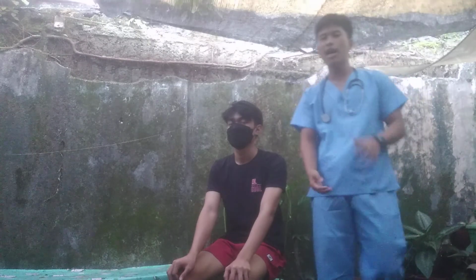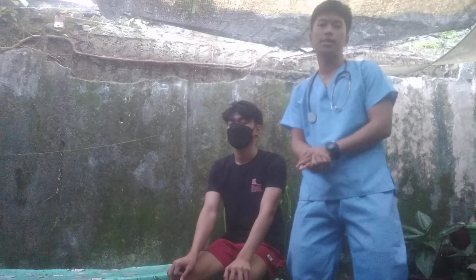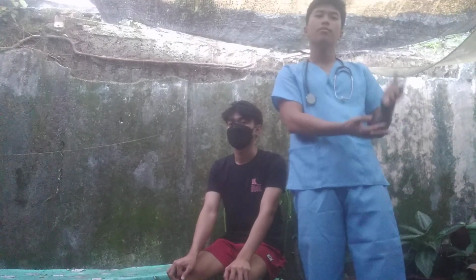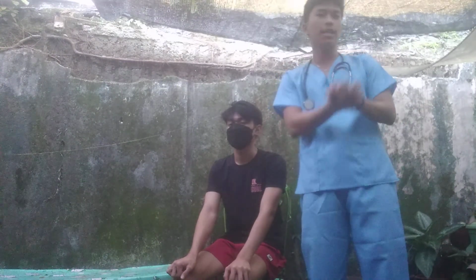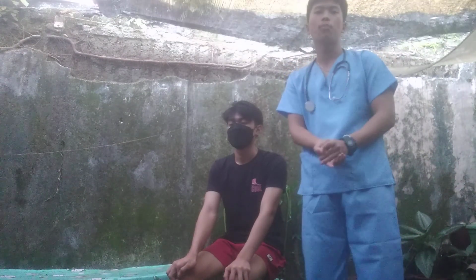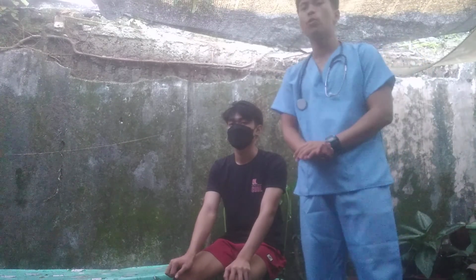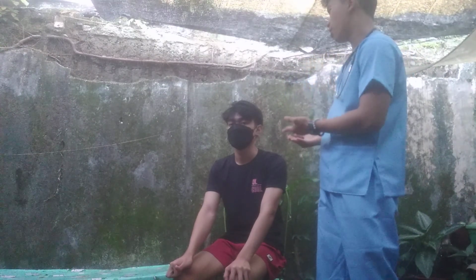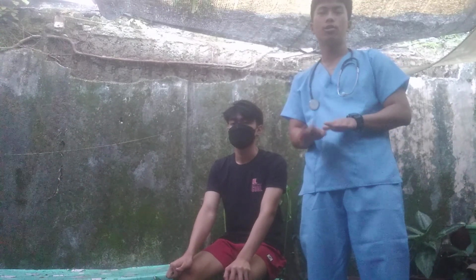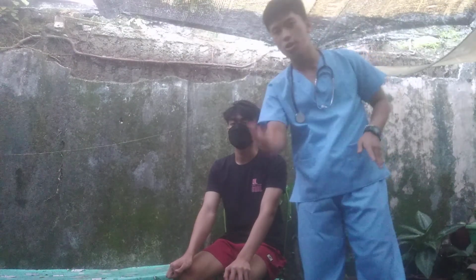Now we will begin with preparing all the necessary materials for the assessment. As you can see, I have already prepared the materials in advance to facilitate organized and proper measurements and to avoid the loss of time. Be sure to introduce yourself to the patient. Sir, my name is Lucas. Explain the procedure to remove or reduce any anxiety of the patient while facilitating cooperation and compliance with the procedure.